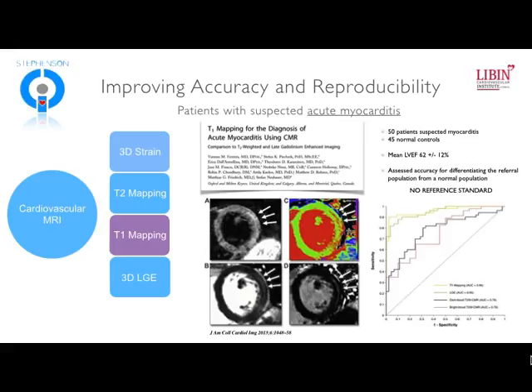So recognizing that, they showed that T1 mapping was as robust as late gadolinium enhancement. Really not any superior to late gadolinium enhancement, but was as robust as late gadolinium enhancement. And what it pointed out was that there was very modest performance of T2 weighted imaging, either using a stir-based technique, so a triple inversion recovery technique, or a bright blood technique.